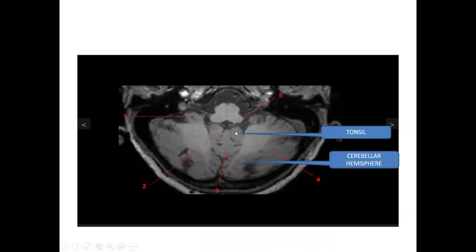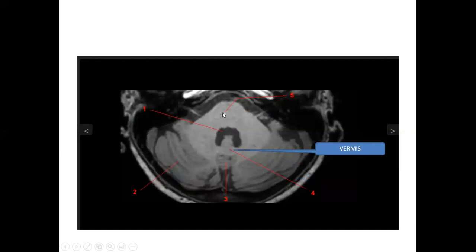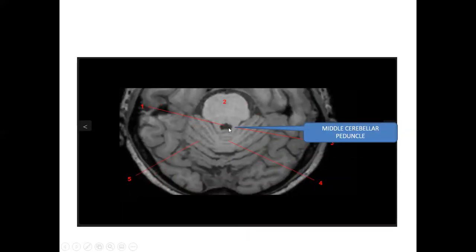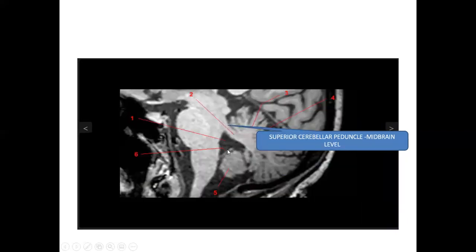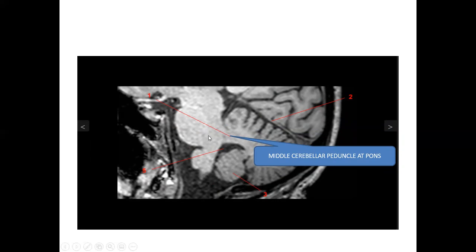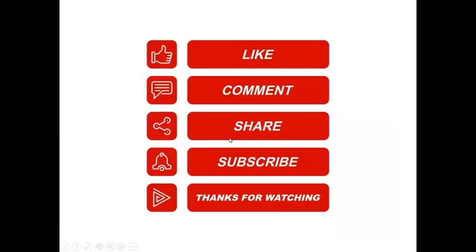You can see the cerebellar tonsils on both sides, the cerebellar vermis, and the cerebellar hemispheres. This is the superior and middle cerebellar peduncle communicating between the pons and cerebellum, and this is the fourth ventricle. The vermis has two parts: superior cerebellar vermis and inferior cerebellar vermis. The middle cerebellar peduncle communicates between the pons and cerebellum, and the superior cerebellar peduncle communicates between the midbrain and cerebellum. You can appreciate the middle cerebellar peduncle here clearly.